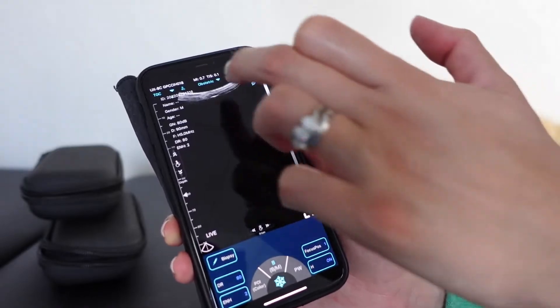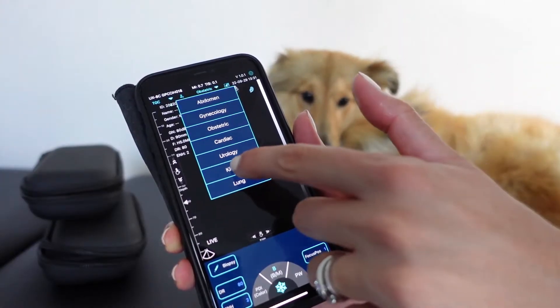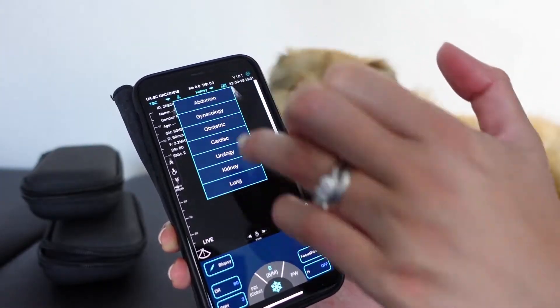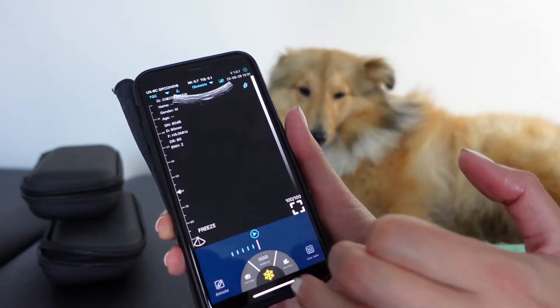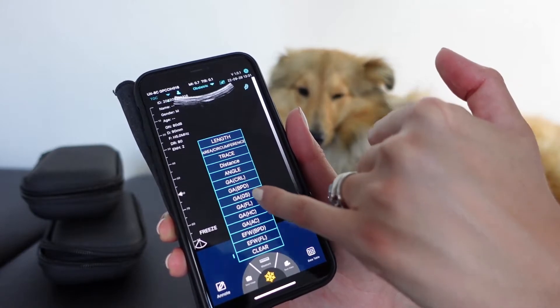Today, we compare two. The app allows for different scanning modes, and whatever mode you're in affects what calculations you have. So in obstetric mode, if I freeze and go to measure, I have all of my gestational age calculations available to me.